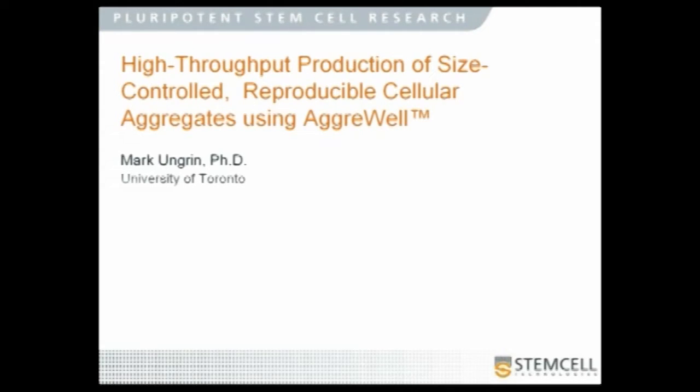I am very pleased to present Dr. Mark Ungrin from the University of Toronto. Mark is the inventor of AggreWell and developed the plate primarily in the context of making Embryoid bodies from human embryonic stem cells. Embryoid bodies are three-dimensional aggregates of embryonic stem cells, and generating embryoid bodies is usually the first step in many differentiation protocols for these cells.